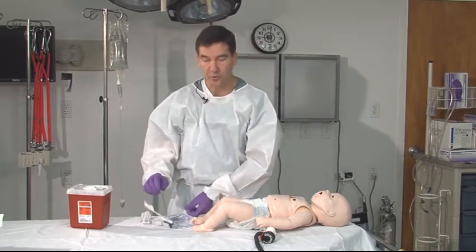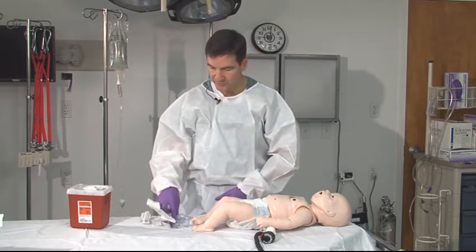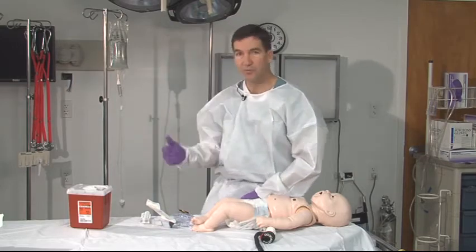When setting up, you want to make sure your equipment is ready to go, your trocar is set, and you have your antiseptics and your fluids set up.